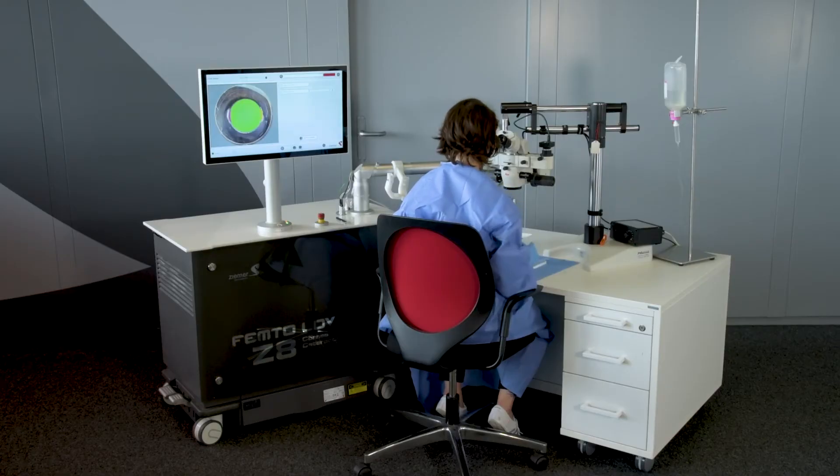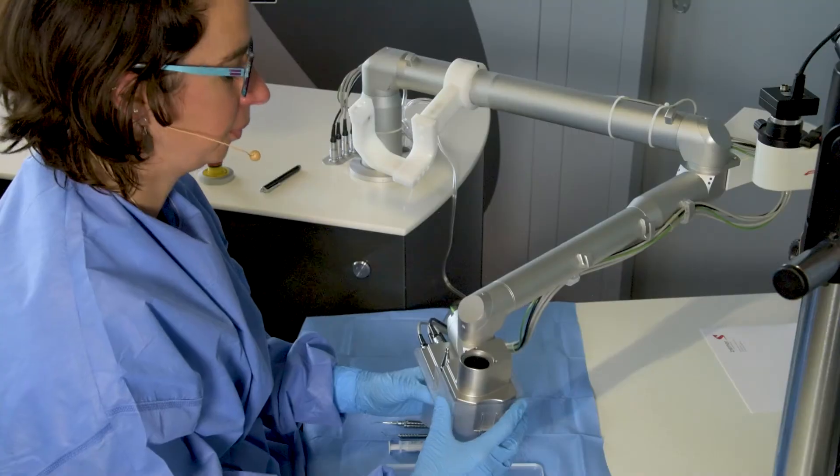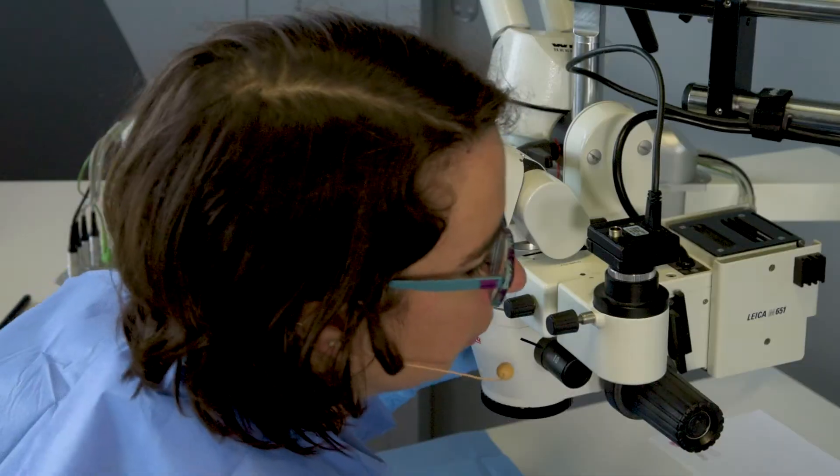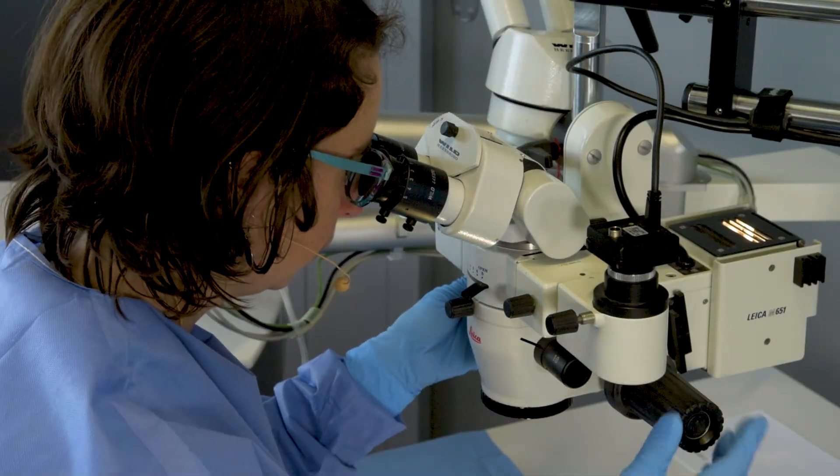So here the cut is finished. I can switch on the light again and I place the end piece back. Then here I see the cut.